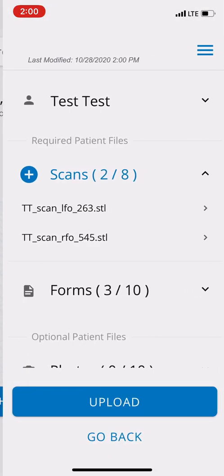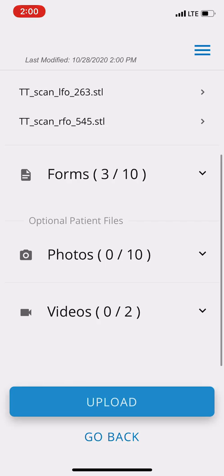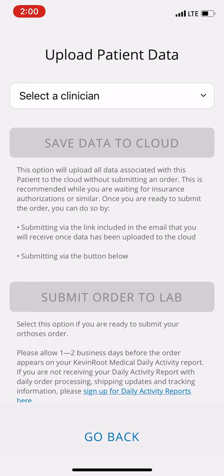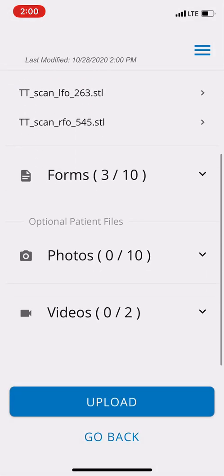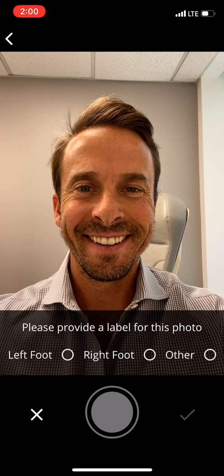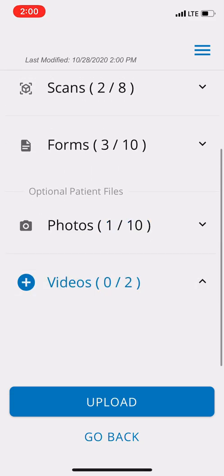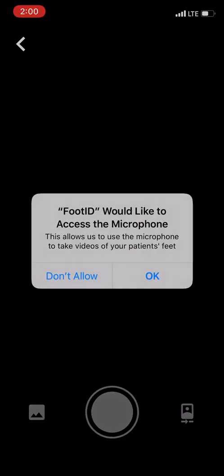Before uploading, let me show you how to add photos. I'm going to spin the phone around and take a photo. Let's do 'other' and I'm going to take a video — add a video, access the microphone. You can take a video clip this way.